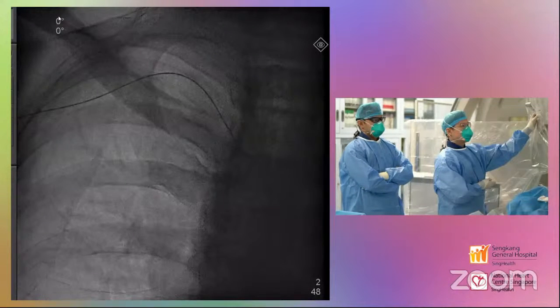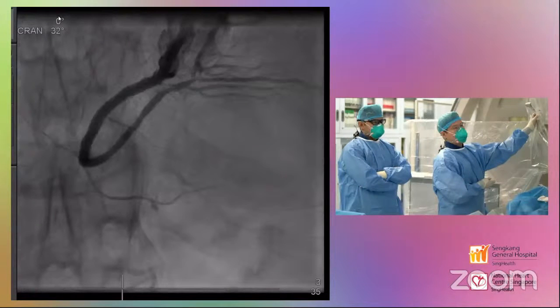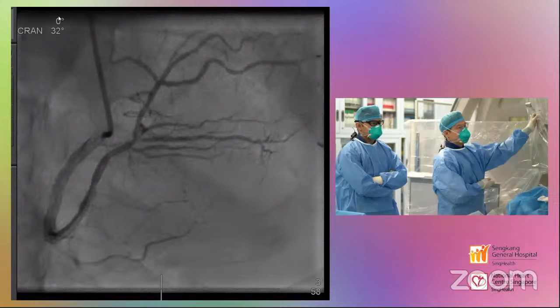And after that, we first took a diagnostic shot of the right, showing that the stents are patent. And we elected to use the radial approach, given the fact that he's elderly. We were considering going through the femoral approach for better support. In the end, we thought that we could still go through the radial approach because he's elderly.